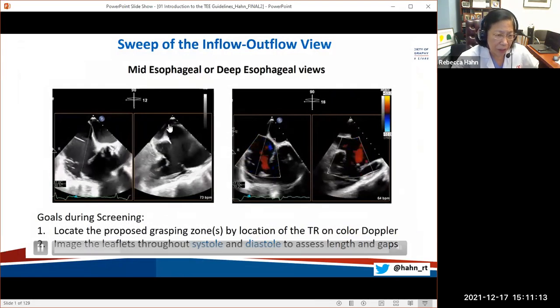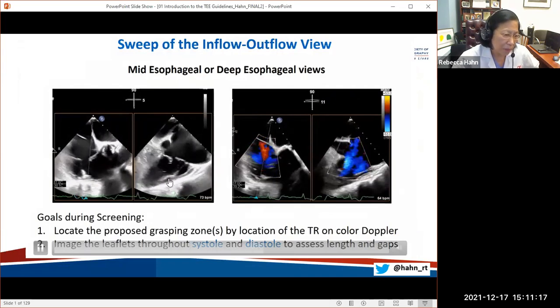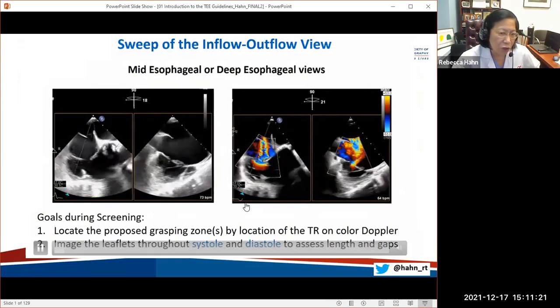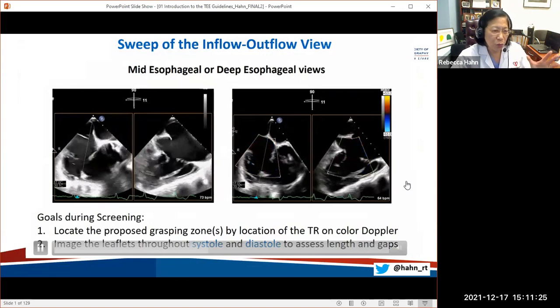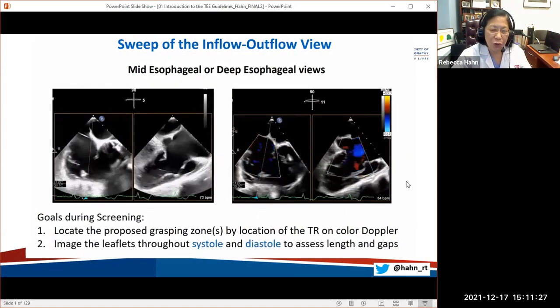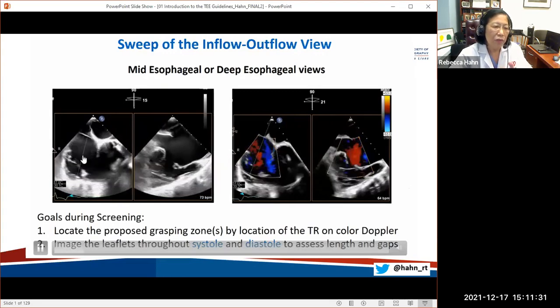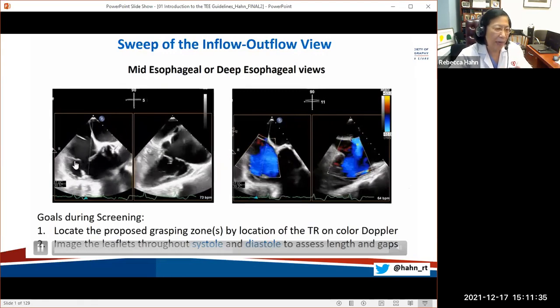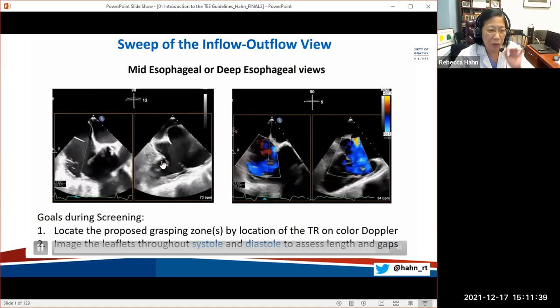You can see very, very little left heart, and really imaging beautifully papillary muscles, chordal attachments, the malcoaptation zone. So these are all really important. And then sweeping across allows you to see the coaptation of the septal leaflet with the anterior leaflet near the aorta, and the posterior leaflet out the posterolateral wall. So remember that septal leaflet is in the third plane.